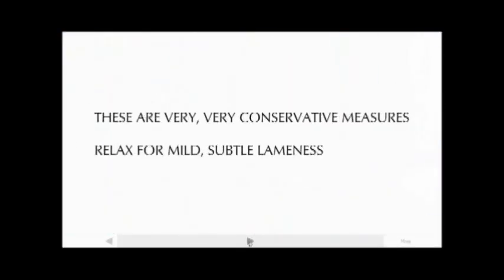This, however, is a very conservative estimate for a significant change. At levels of lameness severity near threshold, or very mild lameness, it is best to relax these stringent guidelines when looking for significant change. With mild levels of lameness, a change in the measure from above to below threshold, for instance, especially when the standard deviations are small, should be considered significant.